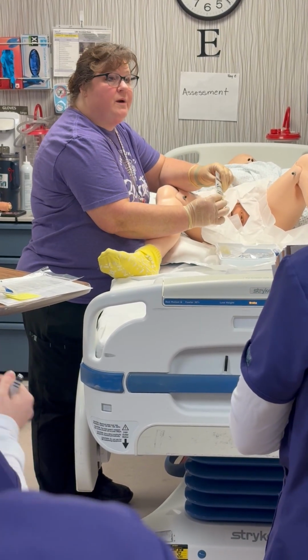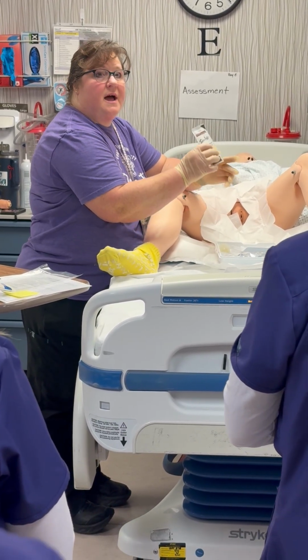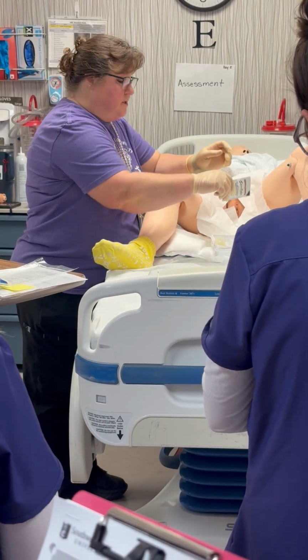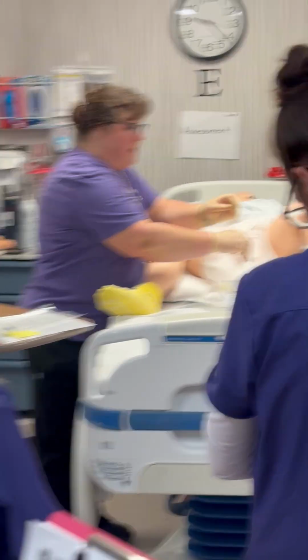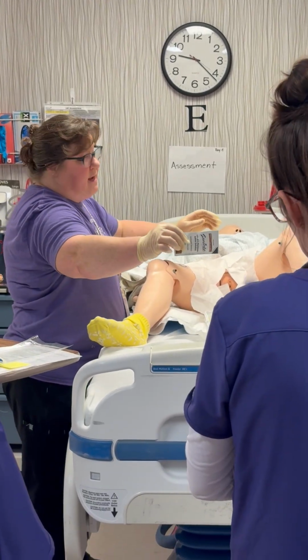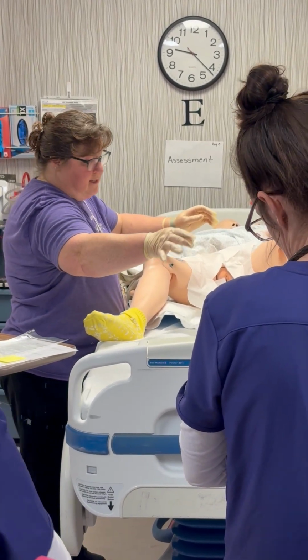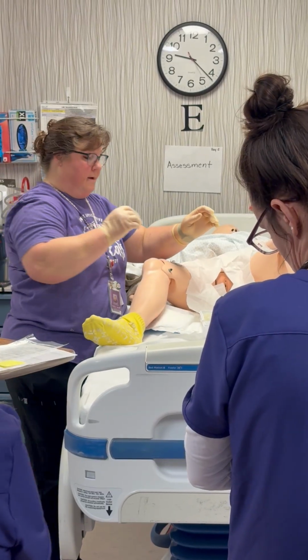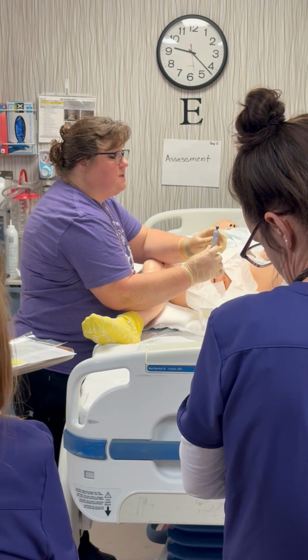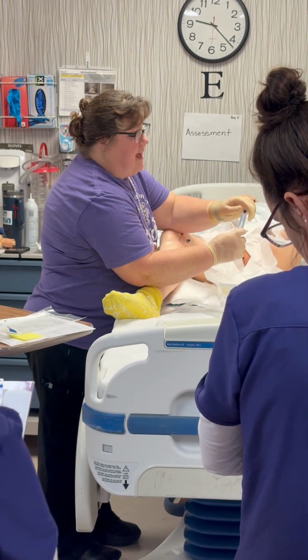So we're going to just simulate that we're putting this betadine. And that's why we asked them, betadine, iodine, latex, silver, shellfish, okay? So we're simulating putting this betadine on, and then we're taking it out and around, making sure what? 6 inches, okay? Next thing to open is my lube, because we have to lubricate that catheter.